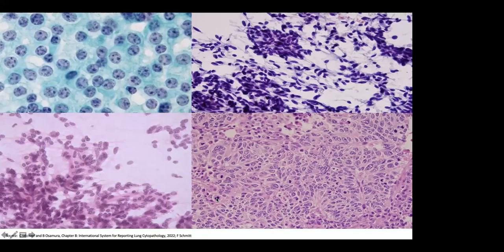Here you can see some figures that are from the book. Look, sometimes they look like plasmacytoid cells, you know, because of this distribution of the chromatin, and carcinoids sometimes enter in the differential diagnosis of hematopoietic neoplasia. Here is the spindle cell, and this is the cell block.